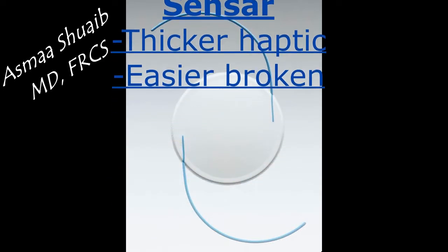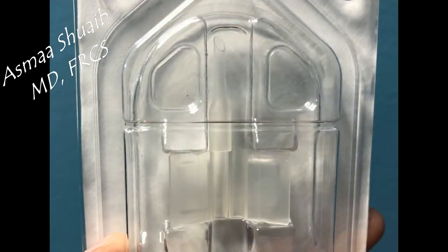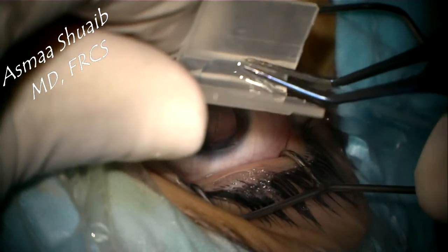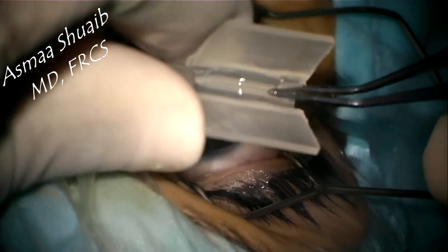Moving to the Sensar IOL, it is characterized by having a thicker haptic that is easier to be broken and not to be bent. This is the cartridge given by Sensar, which is very similar to the cartridges of one-piece foldable IOLs. This type of cartridge can be used with any type of three-piece IOL. The IOL can be loaded by pushing the optic into the gutter and then making sure that the leading haptic is also inside the gutter.